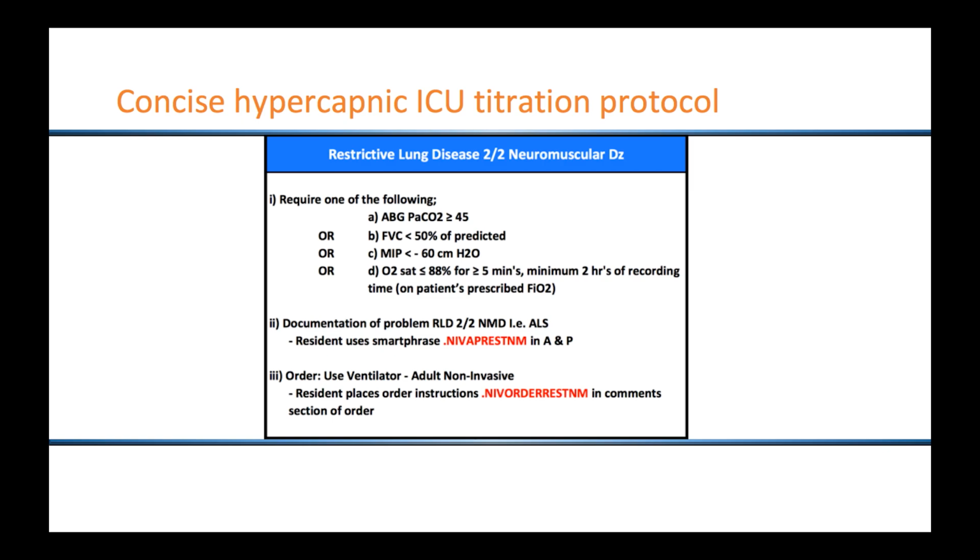In addition, there needs to be appropriate documentation of the problem, and we've created Henry Ford wide smart phrases, as you can see, bolded in red, that are to be placed in your assessment and plan. In addition, the order that you use in these instances should be ventilator, adult, non-invasive, and the resident places that order along with the order instructions in the comments section, and there's another smart phrase bolded in red, which we'll go into more detail on the next slide.